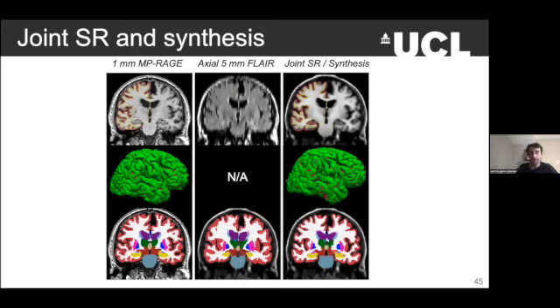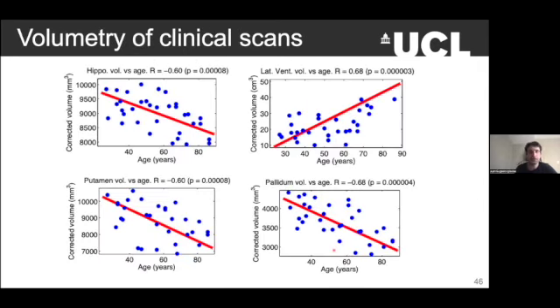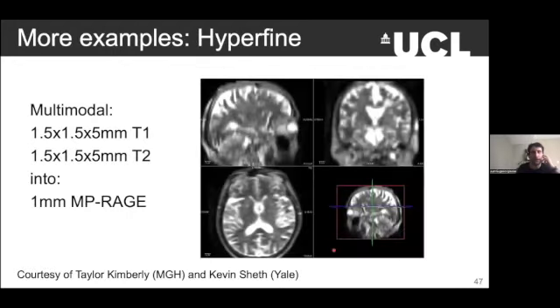And we did this in a controlled environment with a fixed number of sequences first, and we got some nice aging curves with expected effects. So we were happy about that. But we've done a bunch of things with this, maybe for another day, right? But one cool application is hyperfine scans, like low field scans.